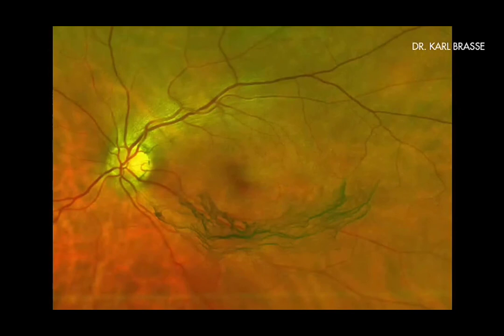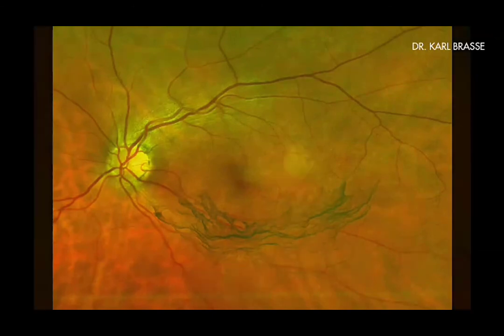This is a Weiss ring formation surrounded by a dense fibrosis of the posterior vitreous membrane. This ocular pathology can be observed quite often in combination with a macular pucker. It requires multiple laser sessions and a lot of laser energy. I recommend to perform them over a period of a few weeks with a constant focus on ocular pressure rises. Still, remnants of the material will remain. You should consider to perform a vitrectomy primarily.